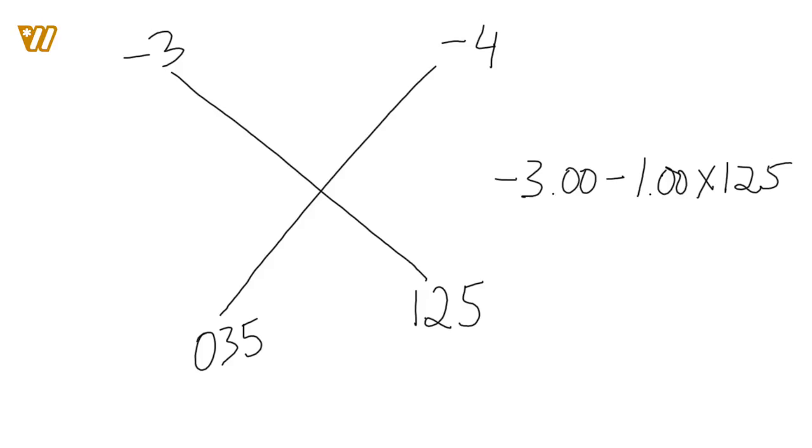Whenever I work these examples in lensometry where they give me a word problem, we're used to doing lensometry and just neutralizing a patient's prescription without even thinking about it. But in a word problem, it can be a little more challenging. I know on the surface this seems like a really easy example, and the truth be told, it is. It's one that we want to be able to dominate if it comes up on boards. I also want to make sure you guys don't skip over this, just like lens transposition, because it's really important to dominate these easier types of questions.